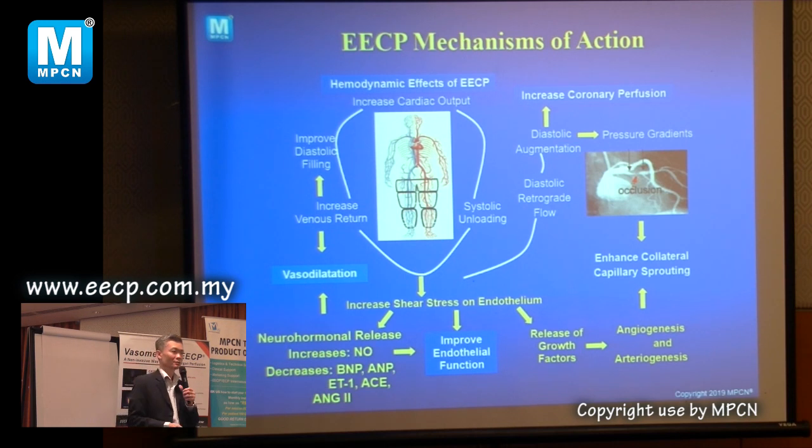Okay, so some of you may say, what is the benefit of doing this? Just now I mentioned, it increases blood flow during diastole. So for those people with blockage, not enough blood flow, it increases blood flow. So this is the mechanical part. By increased blood flow, hopefully the heart can have more oxygen and recover.